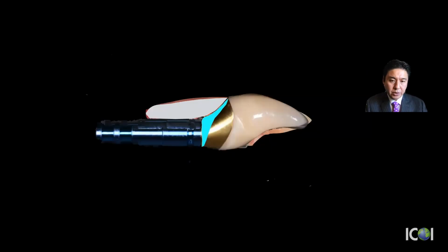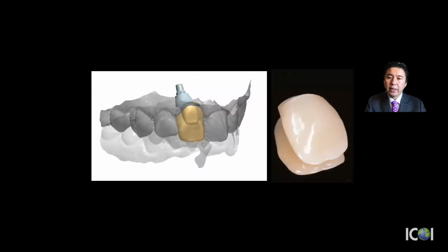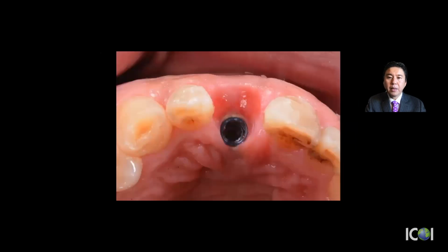So I try to mimic the soft tissue contour, and between the buccal bone and the implant, I put the bone graft material, and the blue line means the soft tissue, the thin layer of the composite to support the soft tissue and also to support the bone graft. And then make a final restoration with this contour, and keeping the soft tissue contour is my goal. So the abutment was made, and also the crown was made by CAD-CAM. So I removed the soft tissue composite layer. You will see this small dot of bovine material captured by soft tissue. Okay, this is dual zone technique.